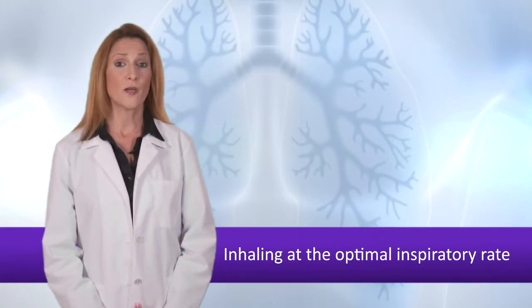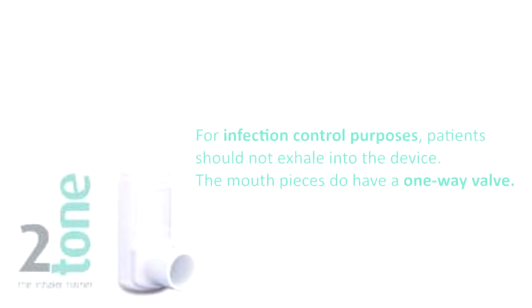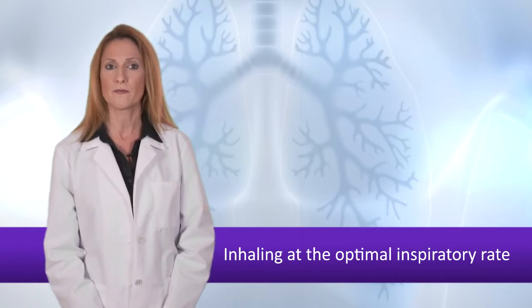There are 2 ways a healthcare professional might use this device. You can use this device with an adapter and a disposable mouthpiece to initially teach patients MDI technique. For infection control purposes, patients should not exhale into the device. The mouthpieces do have a one-way valve. Even so, the device should be cleaned in between patients. Follow any policies by your infection control department.